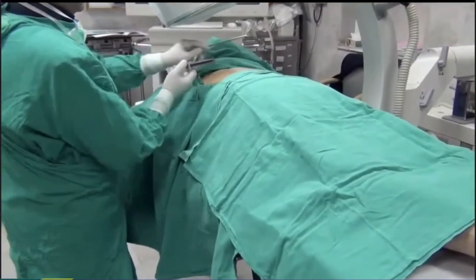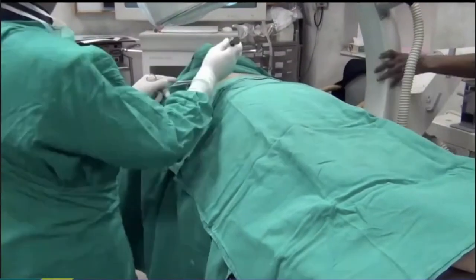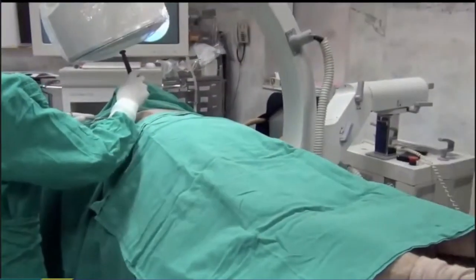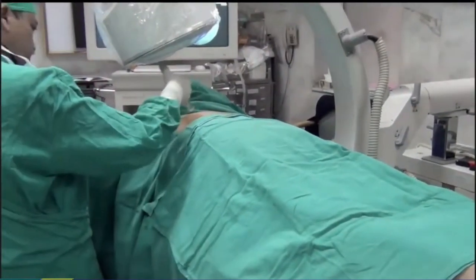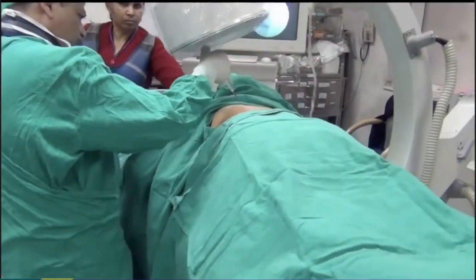Always choose your incision point. Always, very, very important before you start a procedure, just like trigeminal. And then you give your local first, and after giving your local, obviously the patient is not supposed to have a big pain, so you can do mild sedation and post local, which is 26 gauge.